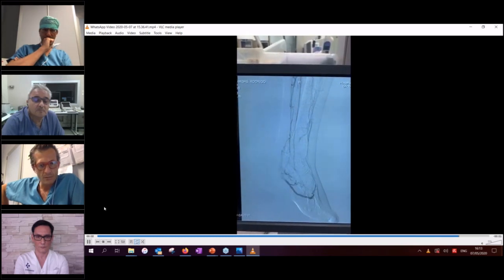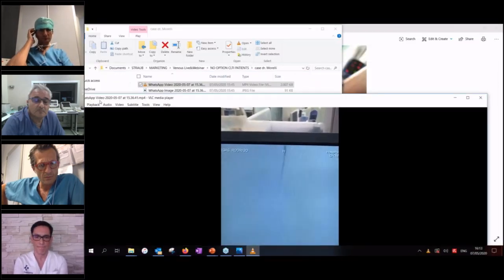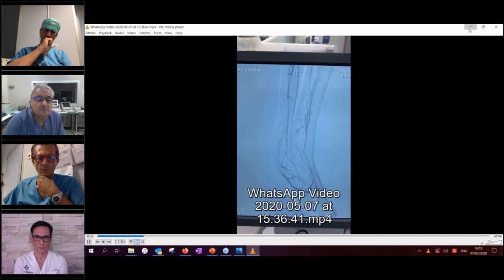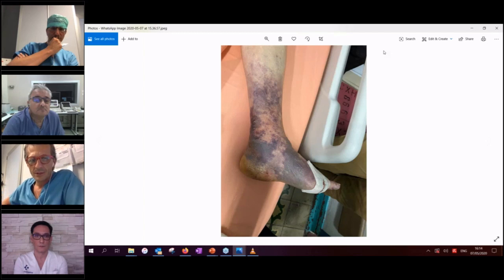Unfortunately, the patient had acute dyspnea and heart failure, and I can also show you the image at the end of the procedure. This is a typical stagnation syndrome. And would you suggest something to Dr. Luis Morelli?